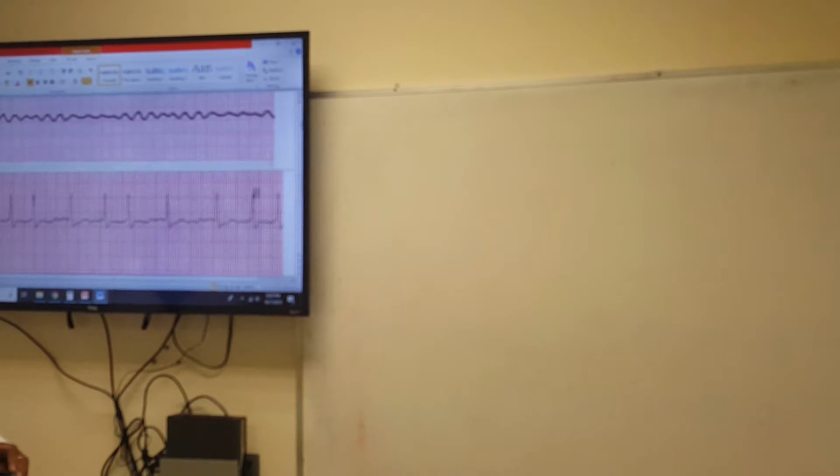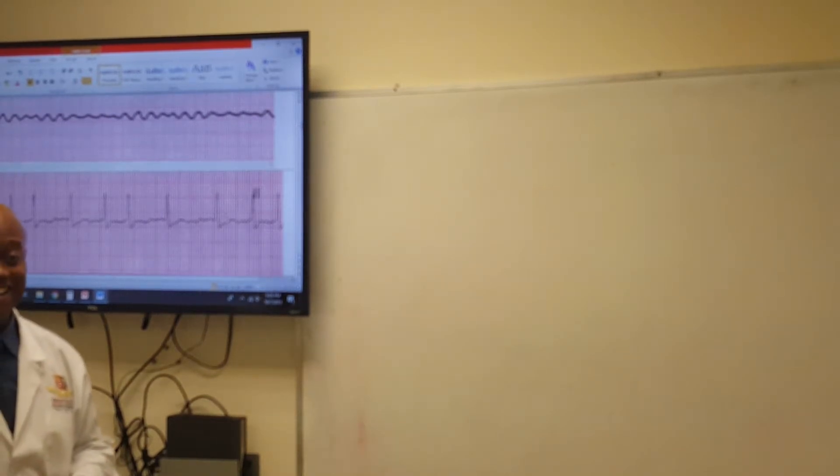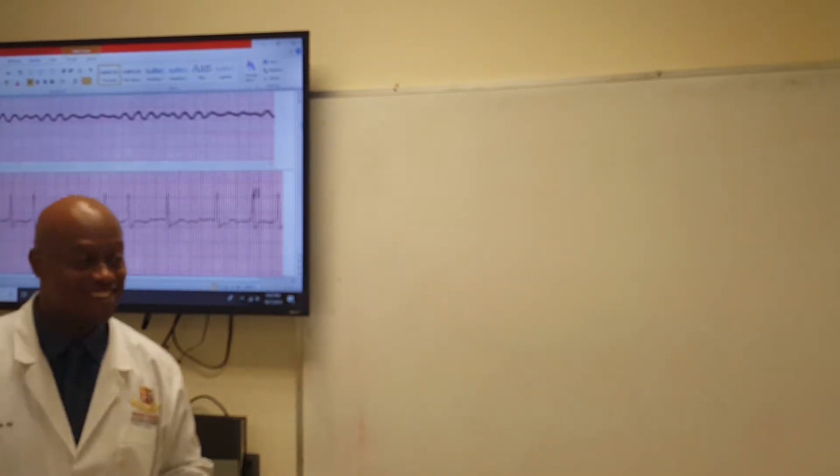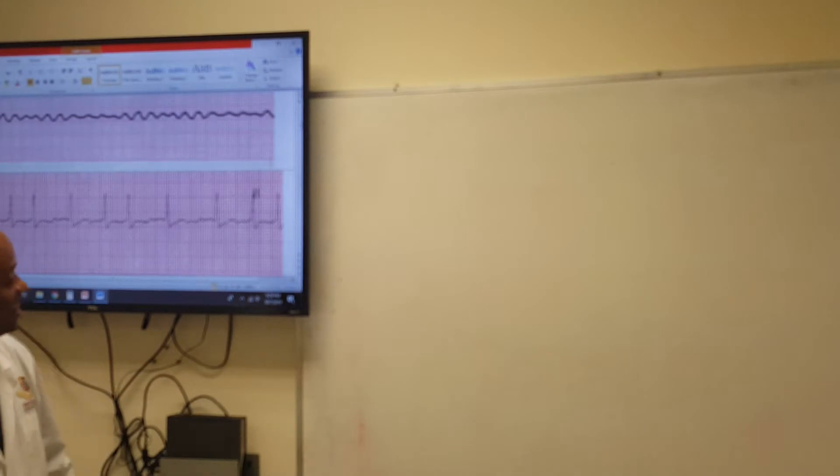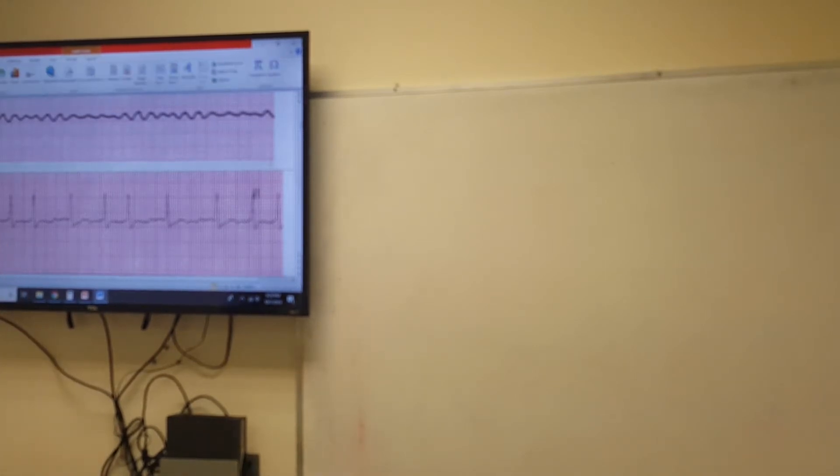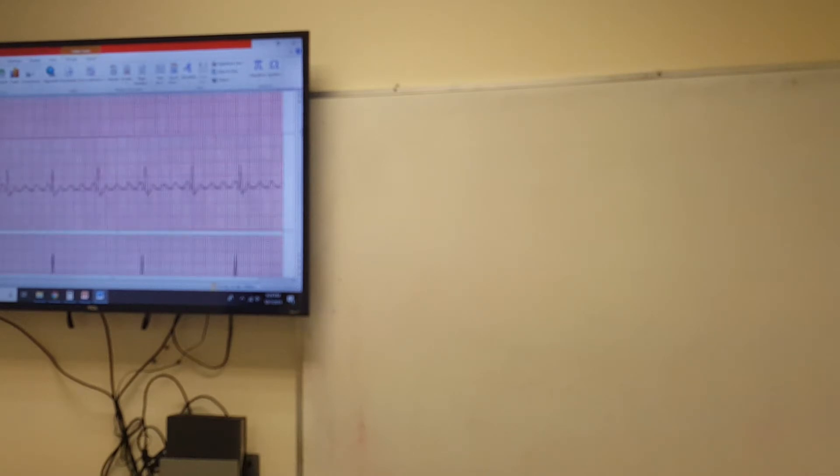A-fib. Good catch. A-fib. Nicely done. So now the next one. This one's a little different. This is a newbie.